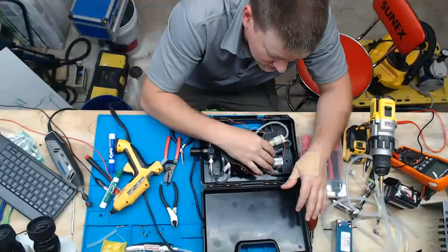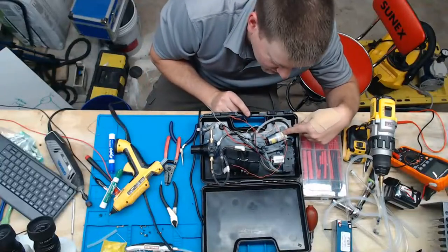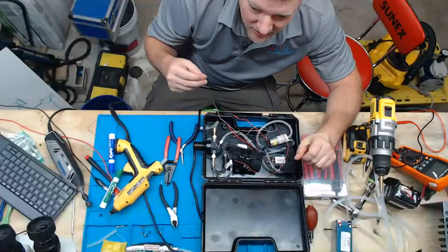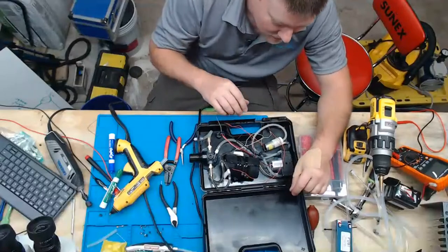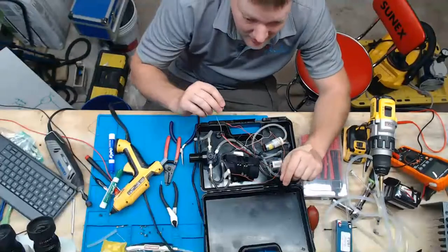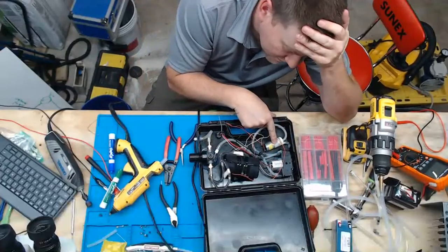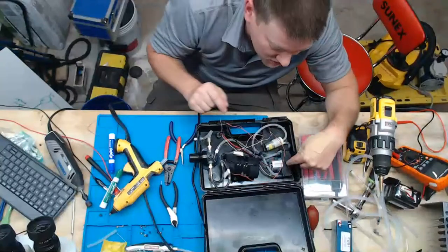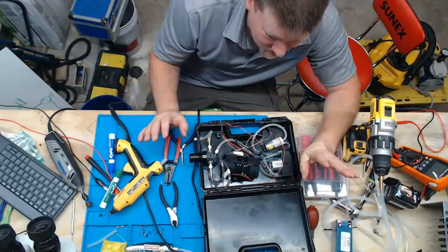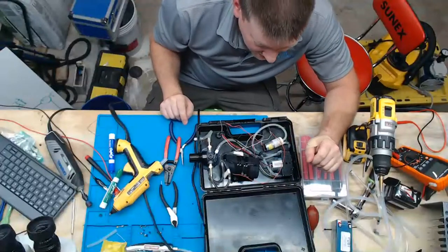Since they use two different technologies, believe it or not, this little guy right here actually puts out more pressure than the large one, but the large one can handle more flow. So the happy medium is to use the little guy as a booster to the big one, and I am getting up to 20 psi. Normally this little guy puts out like 15 to 16 psi, and the larger pump puts out like 12.5 psi. So it's not very much, but together, this pump boosting this one, I'm actually getting about 20.